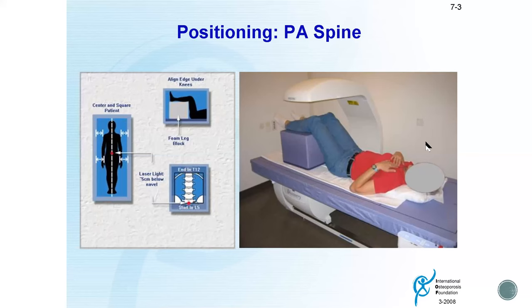So when you have a patient who wants to go for DXA, many of you will have good technologists, radiographers that will do this. But for those of you who may be involved in setting up a unit, these are just some basic things that you might even have to train your technologists or your radiographers to be aware of.